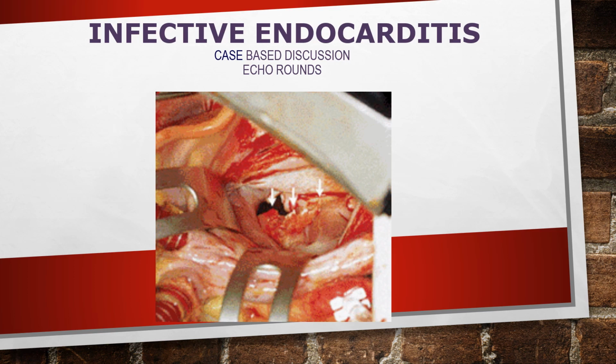Today I'm going to speak about infective endocarditis, and this is going to be a case-based discussion. Recently, we have had a lot of infective endocarditis cases with complications, so I thought speaking about that will shed some light on this important subject.